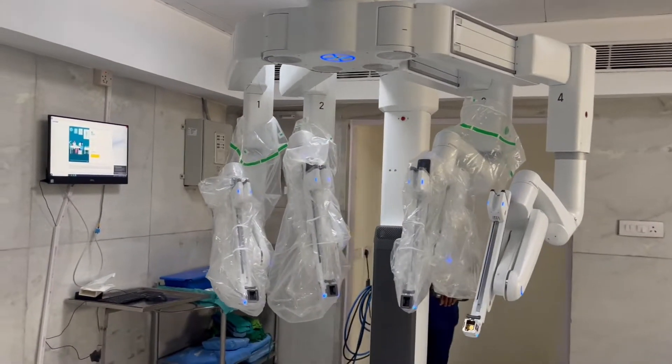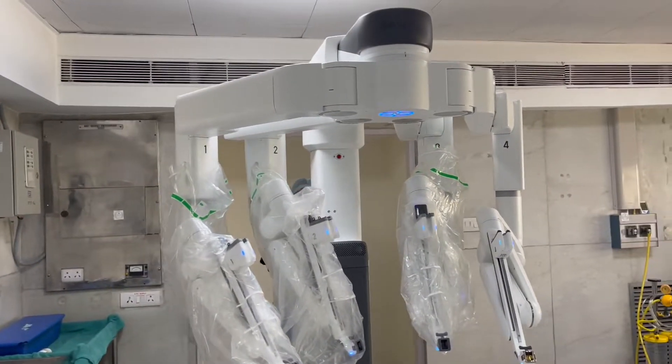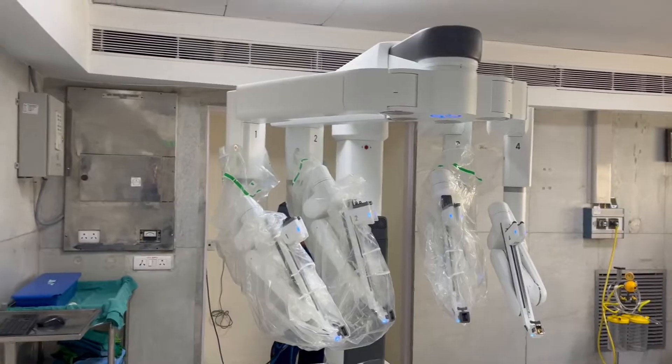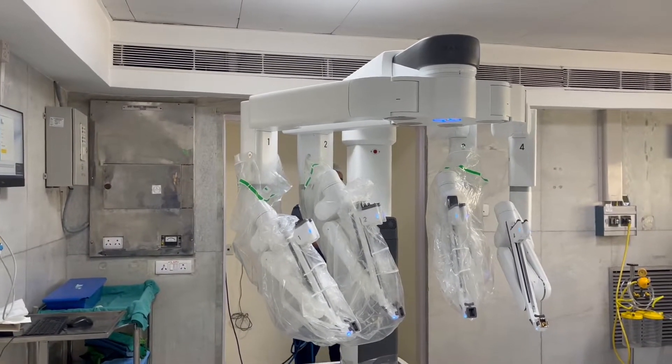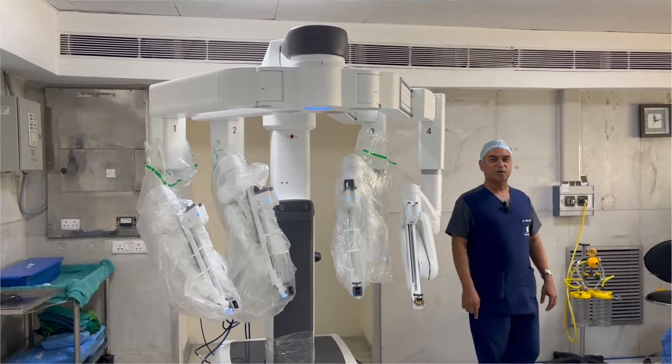Now the robot is reluctantly going back to its original position. Next, I am going to show you how the instruments work.